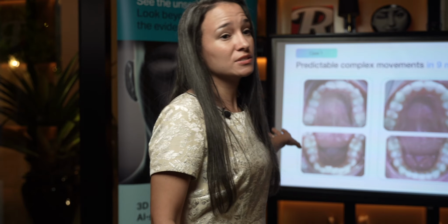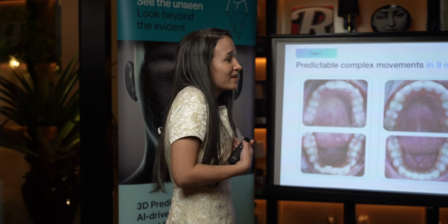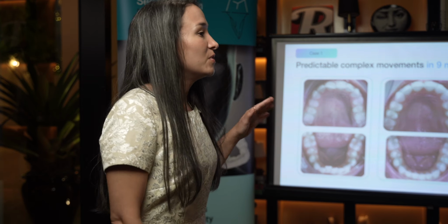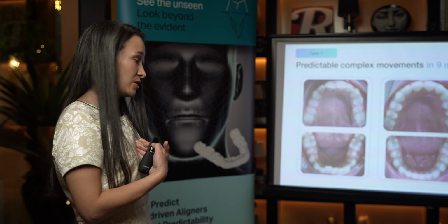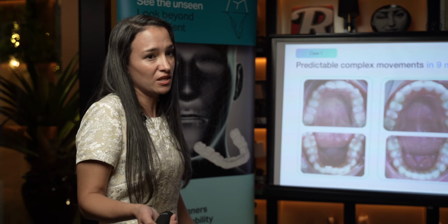And this was a non-CBCT case. I want to make it clear. Non-CBCT. We didn't reach out to the doctor and say, we need CBCT in this case, because we felt that the movements were within all anatomical limits, because we know, based on our database, and because this patient was 17, she didn't have ortho relapse.